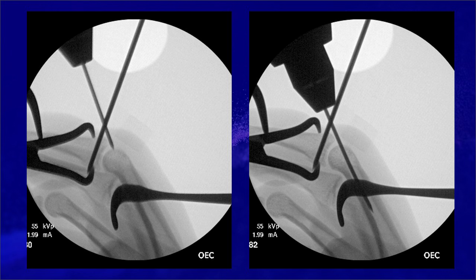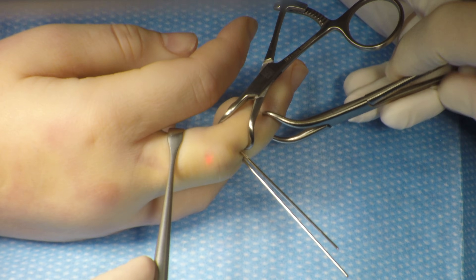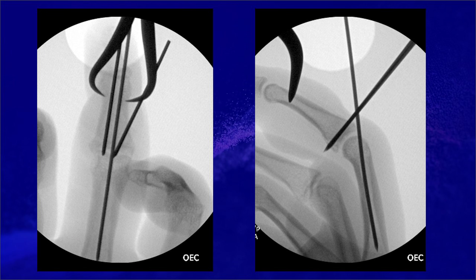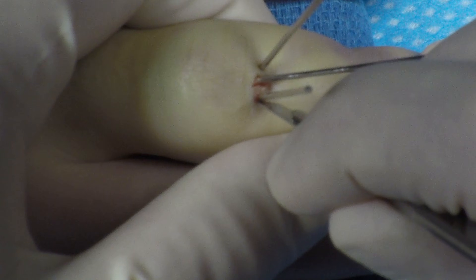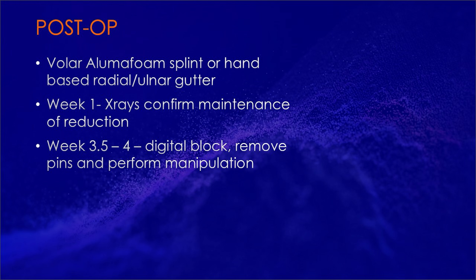A dorsal extension block pin is placed to protect the repair. I keep the volar-dorsal clamp on until the extension block pin is in. The joint is flexed 30 to 45 degrees — a rag-and-retractor can help flex the joint. X-rays show restoration of the concavity of the joint with a congruent reduction and no dorsal V sign. I have a very low threshold to make relaxing incisions around the pins, as you don't want any tension on the skin, which can lead to pin tract infections. The finger is placed in a volar aluminum splint — you could also use a radial or ulnar gutter splint.